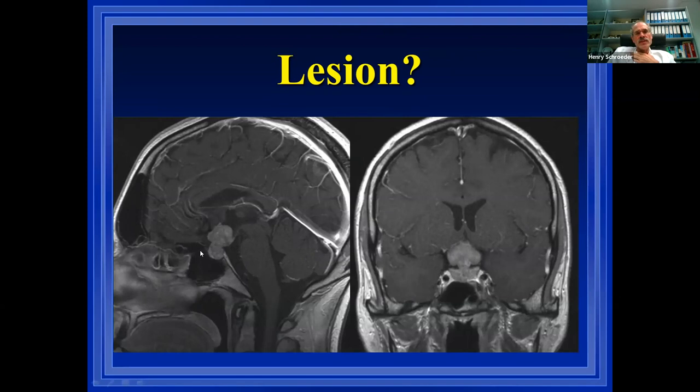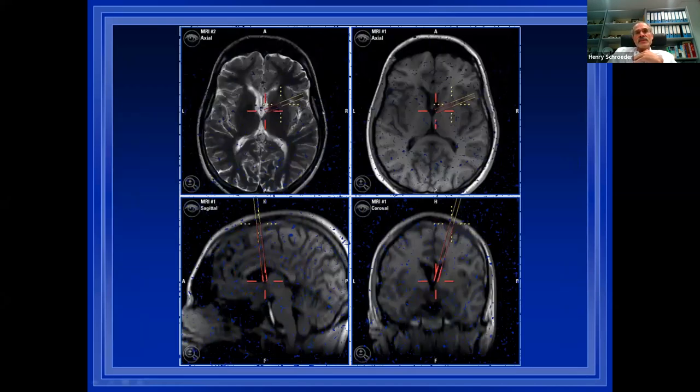Initially, we were thinking to take an endonasal biopsy, but then we said, probably this patient will require radiation. And then we have the problem of a CSF leakage, because the region is exactly where they make the radiation. So that's why the decision was made. I said it's better we come and make a transventricular biopsy. But you see the ventricles are very narrow. Left is a little bit wider than the right one, but still narrow. And then I think it's clear you use navigation. You want to have navigation to go to the ventricle.